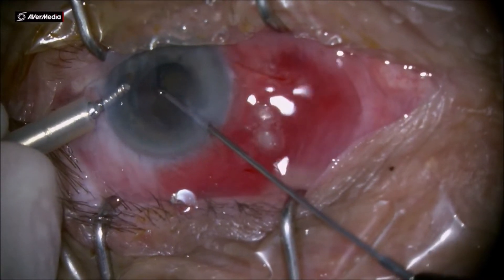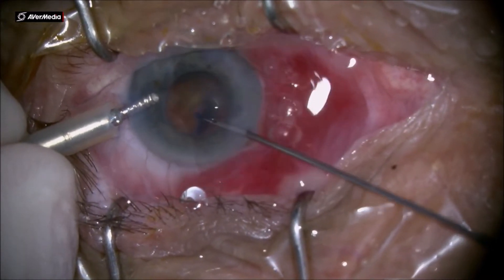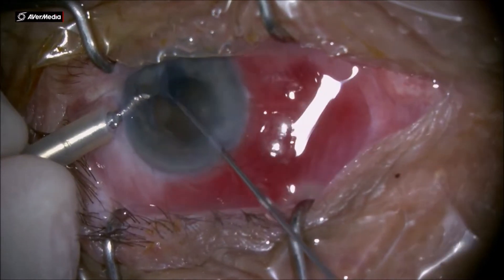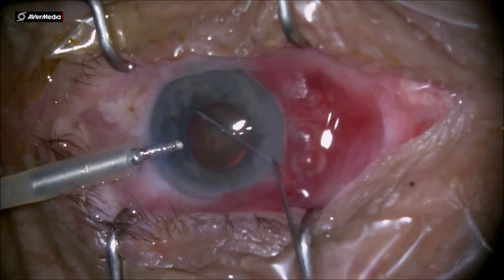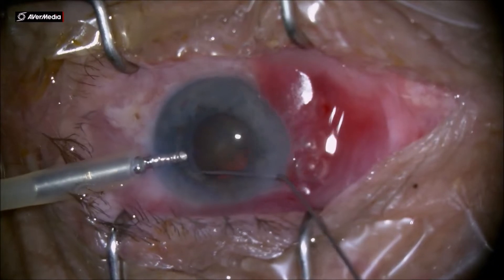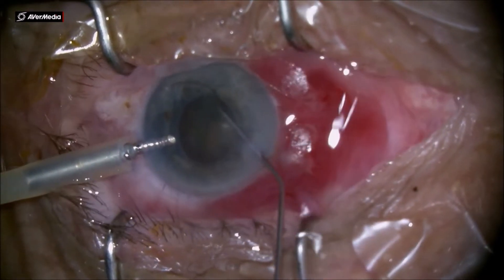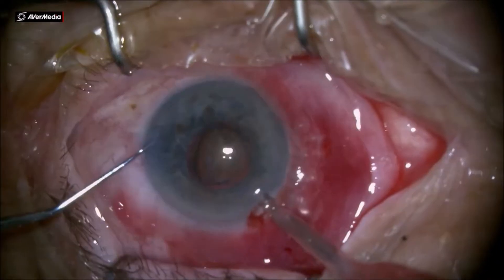The capsulorhexis is done aiming for a fairly larger than the pupil capsulorhexis, so it's done a little bit underneath the iris margin, the pupillary margin. I do dissection and I will not try to rotate too much the nucleus in this glaucoma patient — the anterior segment is pretty fragile, so I don't want to damage the zonules in any way.